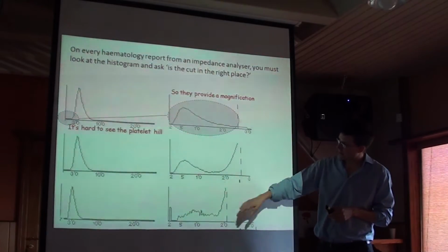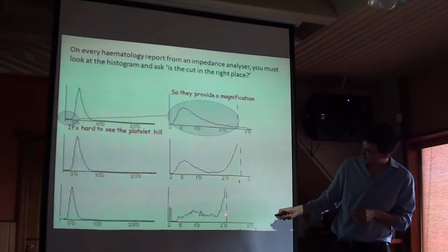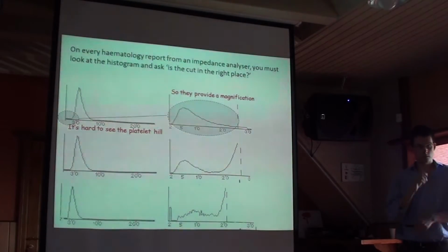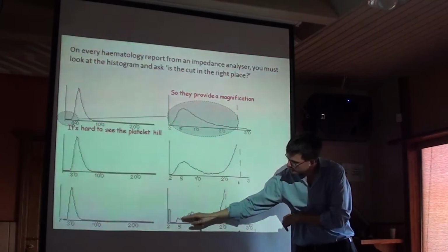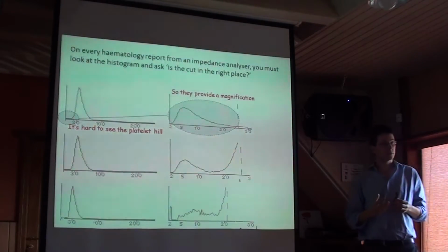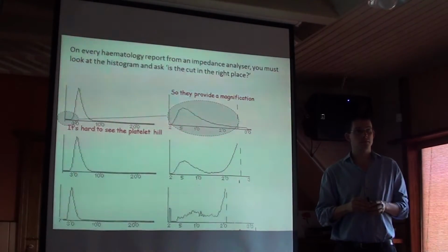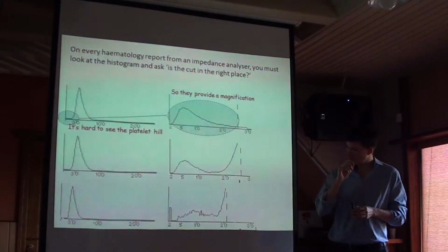What about in this next patient? We can see the hill for the red blood cells and magnification of that area just here. Ja siin on järgmine patsient, kus on jälle küsimus, et kas see joon on õiges kohas. Can anybody guess what has caused this pattern? Mis võiks olla selle mustri põhjuseks? It's platelet aggregation. See on verelistakute omavaheline kokkukleepumine ja agregeerumine. You will see this in many of your feline patients. Seda on kassidel väga palju.